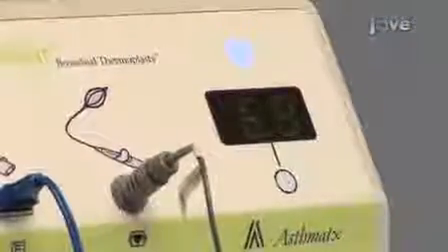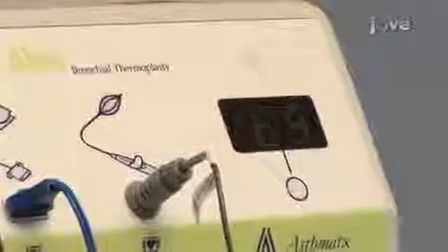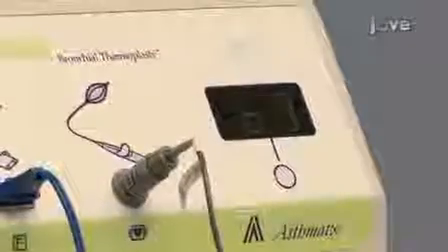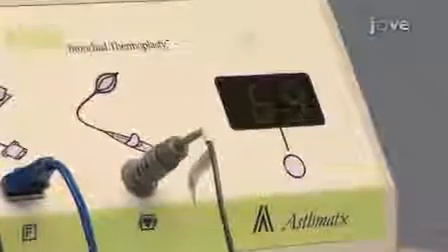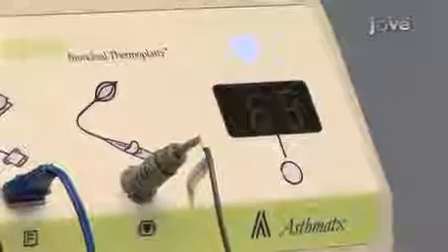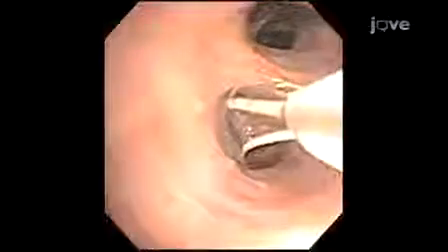The RF controller delivers low-power, temperature-controlled RF energy to the airway and automatically terminates the energy delivery upon completion of the cycle. A long audible tone by the controller signals the end of RF energy delivery and that the treatment cycle is complete. A single activation of the catheter delivers RF energy over a distance of approximately 5 mm, the length of the exposed electrodes within the electrode array.